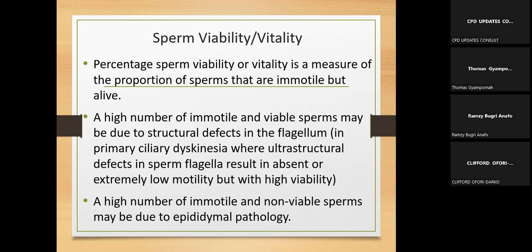A high number of immotile and non-viable sperms may be due to epididymal pathology. All right, so if the sperms are immotile and also non-viable, it means that they are dead.